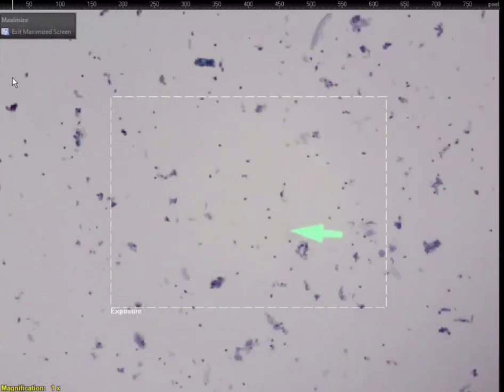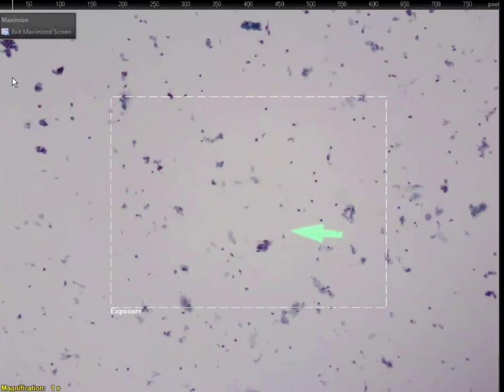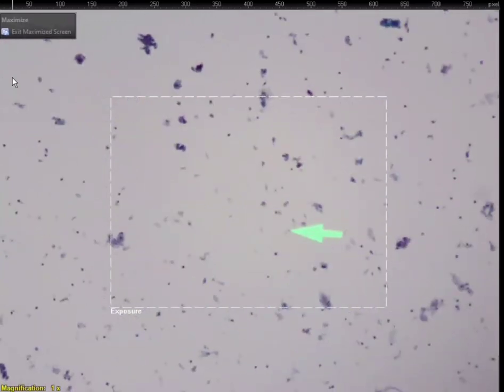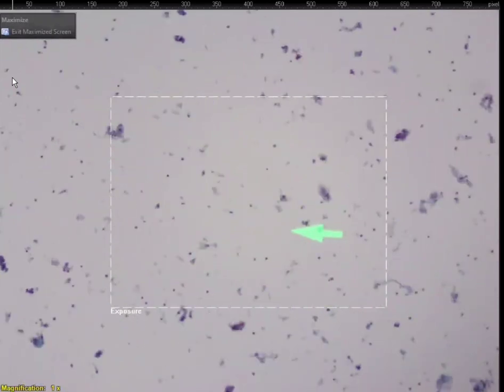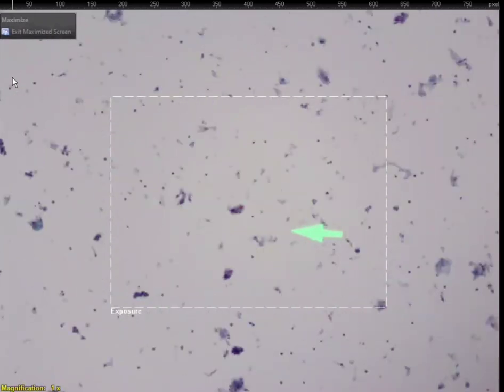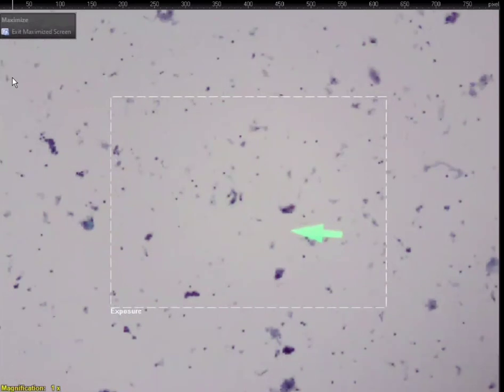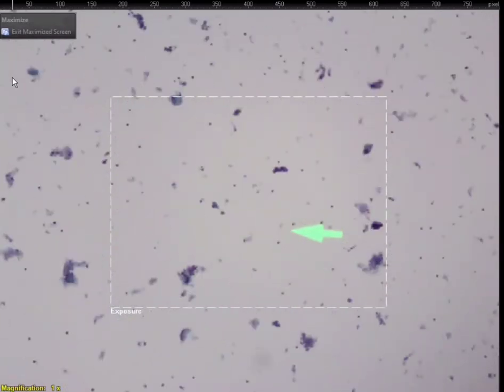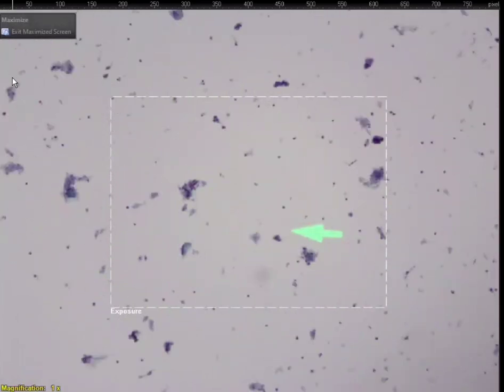Lymph node sample. Where is the sample picture? Because I'm seeing all this respiratory epithelium, I'm saying this was during a bronchoscopy procedure and they went through bronchial, like a lymph node. Perhaps it's a mediastinal node, but they went through a bronch. Not a wash. Yeah, EBUS. Yeah. Okay. All right. But so much contamination. This is terrible.